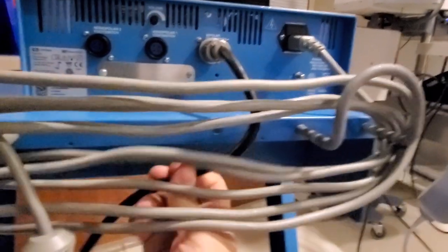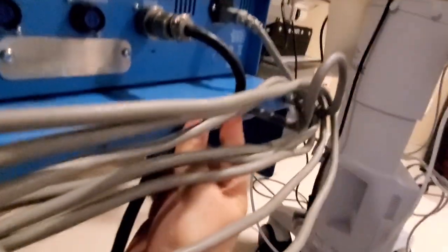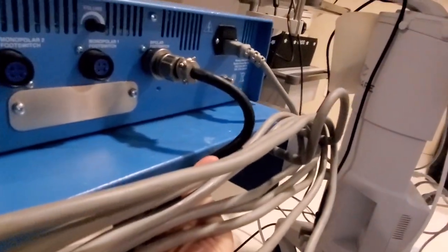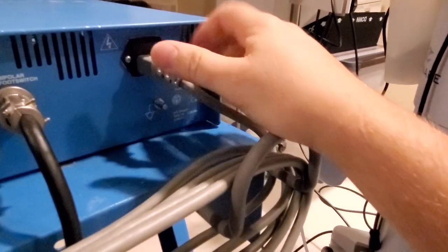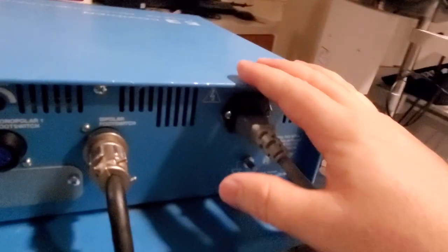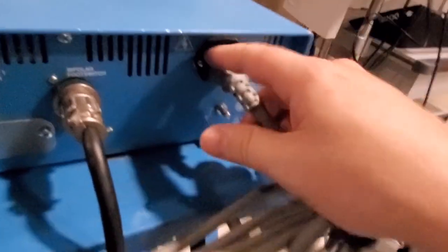And what we try to do is minimize those weak points by zip tying the cables up, and it creates a tiny little service loop. You see that? Same thing goes for the power cords. I mean, we electrical safety this guy with a power cord. So with this cord being stretched really tight like it is right now, it's actually kind of pulling it out of the socket a little bit.